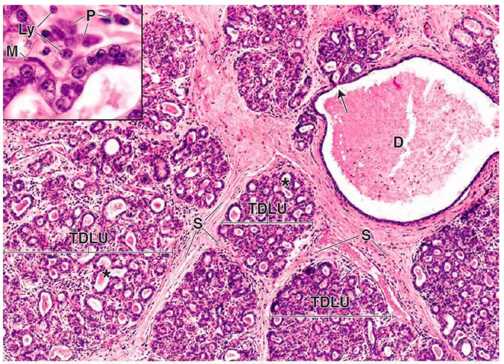The lipid component begins as droplets in the cytoplasm that coalesce into large droplets in the apical cytoplasm of the alveolar cells and cause the apical plasma membrane to bulge into the alveolar lumen. The droplets are surrounded by a thin layer of cytoplasm and are enveloped in plasma membrane as they are released. The initial secretion of the first days after birth is called colostrum.